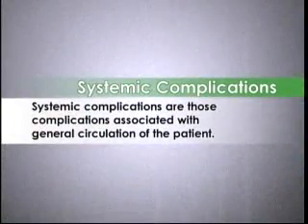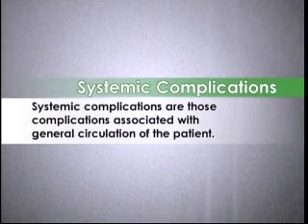The course materials detail potential complications associated with peripheral intravenous catheters. In this segment, we're going to continue to discuss systemic complications and finish by discussing methods to prevent complications. Systemic complications are those complications associated with general circulation of the patient.